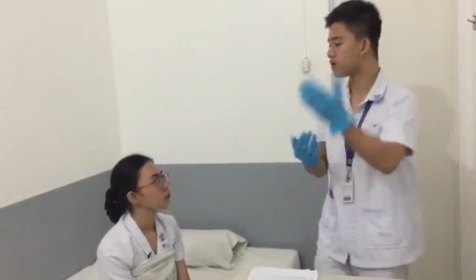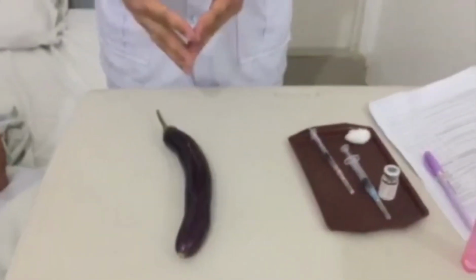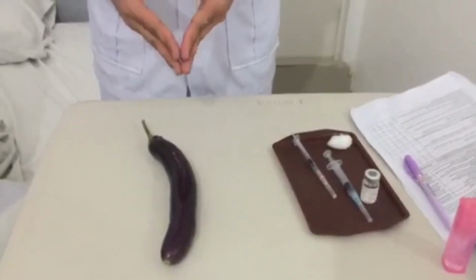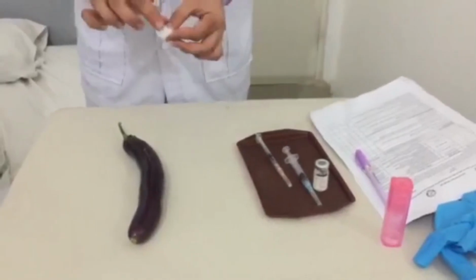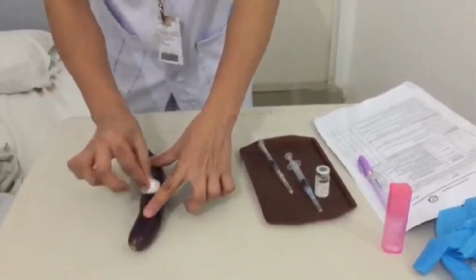And for your comfort and privacy, I already closed the doors and closed the curtains. Also assist the client to a position in which the arm, leg, or abdomen can be exposed depending on the site. As agency protocol indicates, clean the site with an antiseptic swab, start at the center of the site and clean in a widening circle to about 5 cm or 2 inches. Allow the area to dry thoroughly.